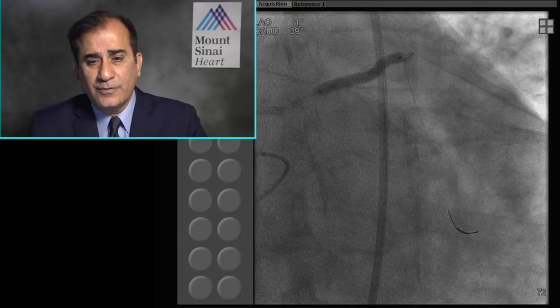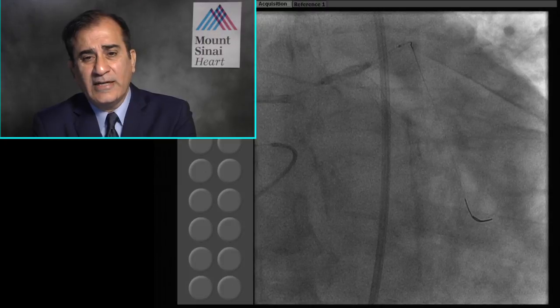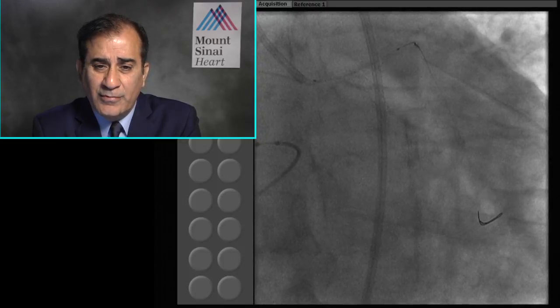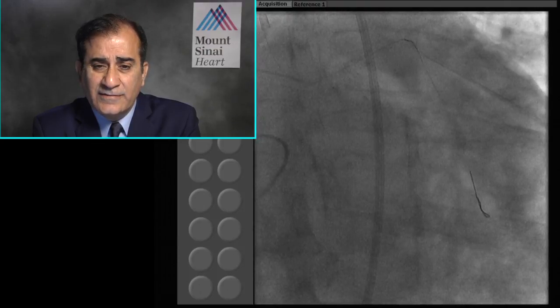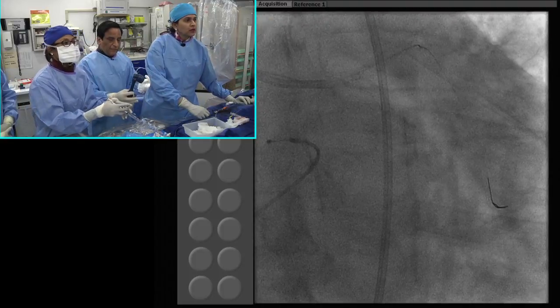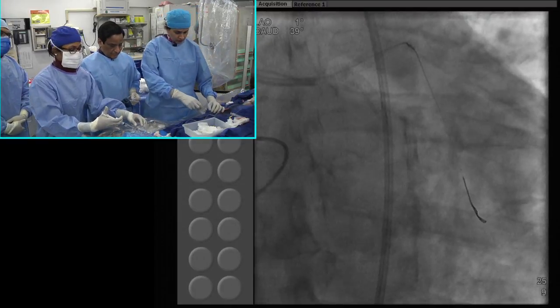Samin, just to also mention the excellent review you made today, I would urge our viewers to look at a beautiful editorial by Dr. Michael Mack and Dr. David Holmes in JACC Intervention, where both of them also relate to another important BVS advancement, that patients several years after having BVS still are excellent targets for surgery. Yes, that definitely is another very big point. All looks right, wonderful, looks excellent.